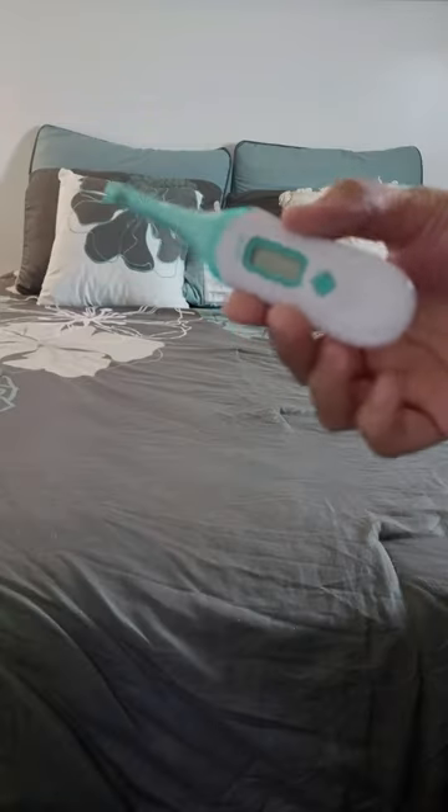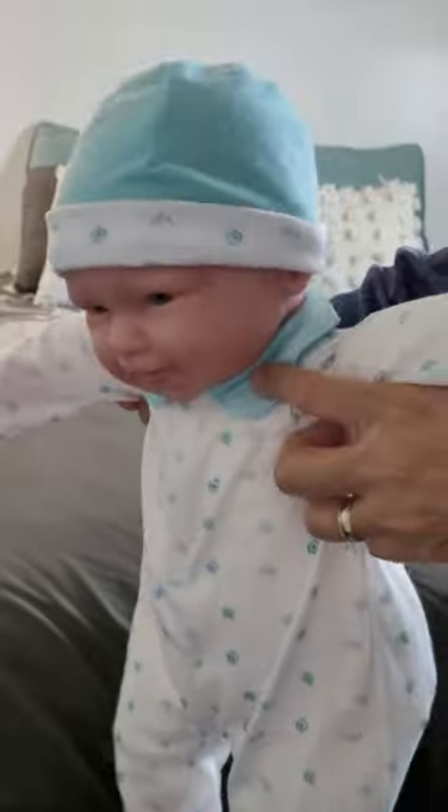Do you know how to check your baby's temperature the right way? Let me show you in 3, 2, 1. First, gather your supplies. You will need a digital thermometer, an alcohol swab, and a baby.